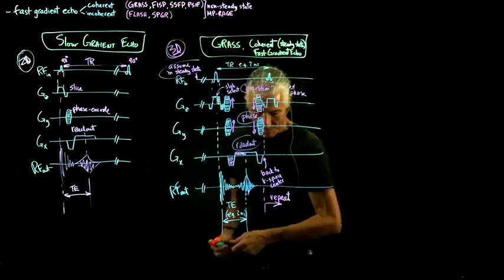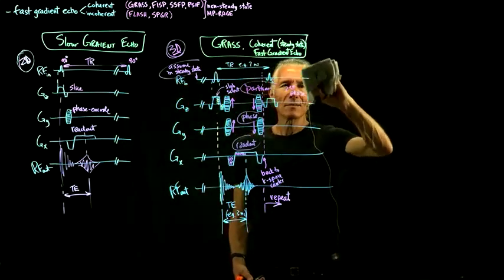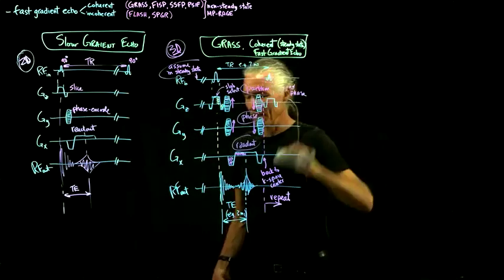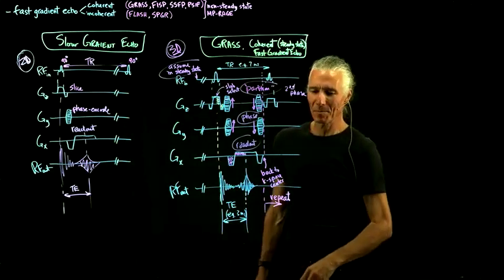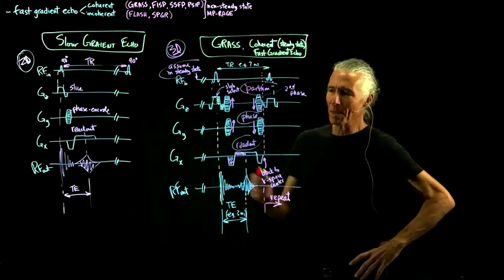So this sequence is pretty unfamiliar. Most people haven't even used it. It's been on the scanner forever. It was already there in the early 90s or late 80s or something. But people don't use it very much. It has a very strange look to it.